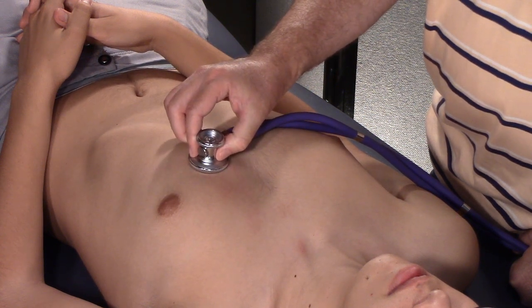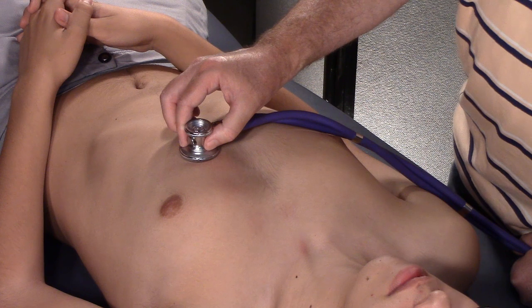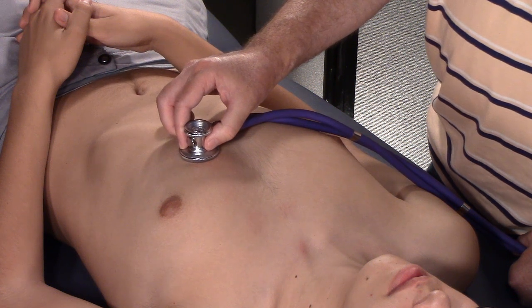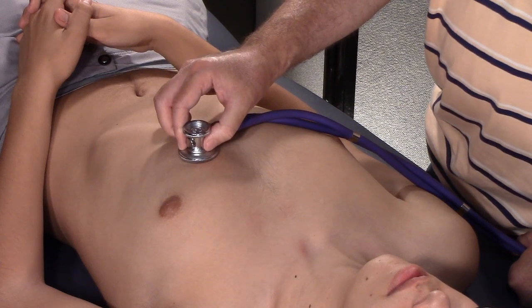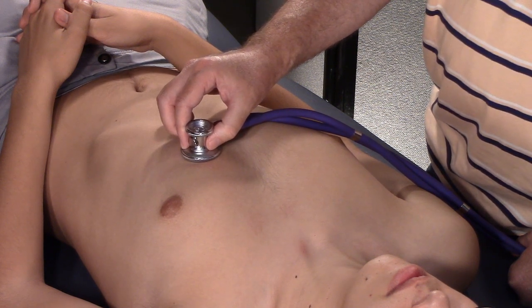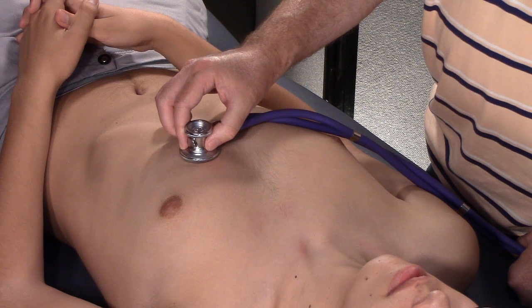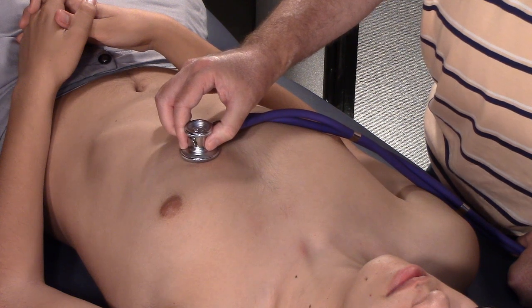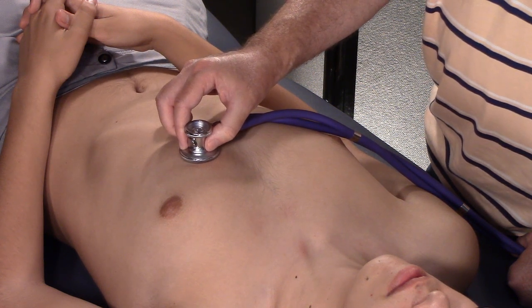Inching down — there's the fourth, then the fifth. You should take your time and listen to the heart. What are you listening for? The rate of the heart, the rhythm, and the amplitude. Listen for the S1 heart sound. With rhythm, you're listening to S1 and S2 together — lub dub, lub dub. Then focus just on the S1 lub, then focus your mind on the S2 dub. You're listening for any splitting, any gushing, any regurgitation murmurs.